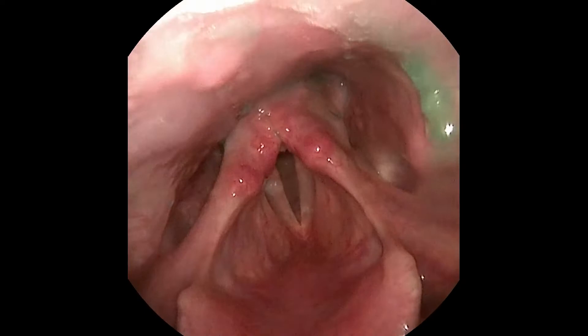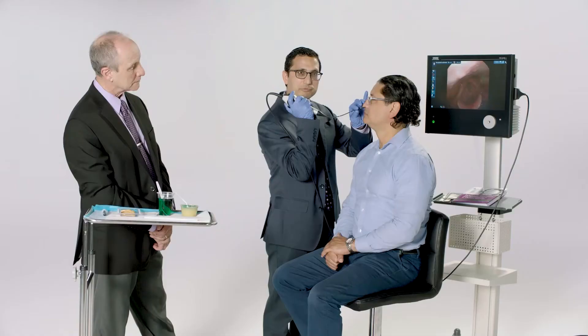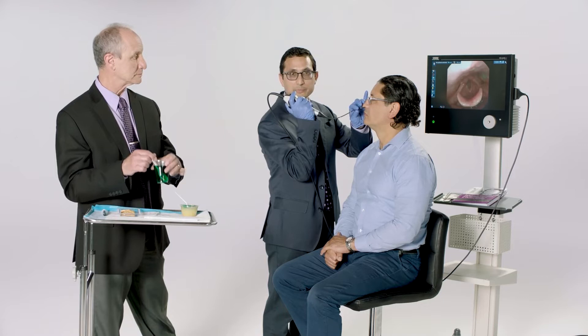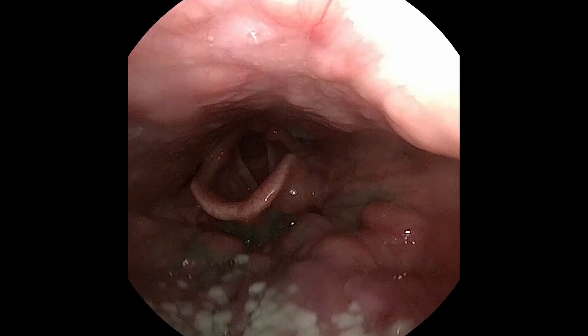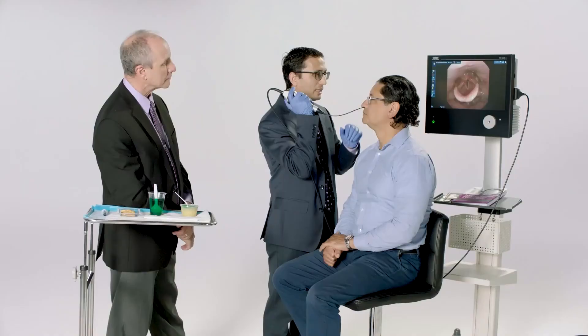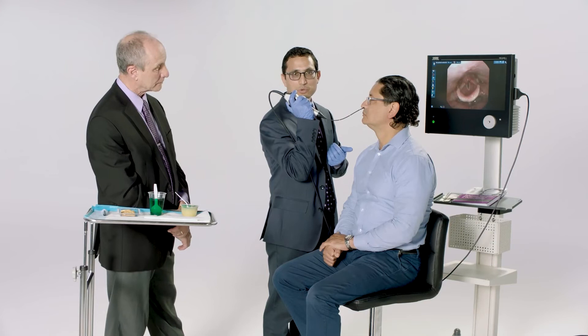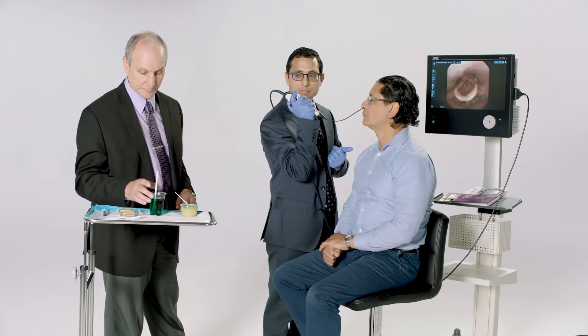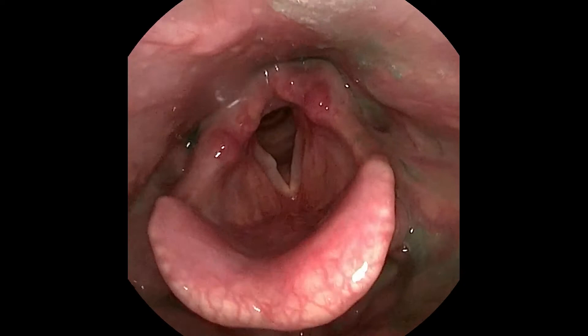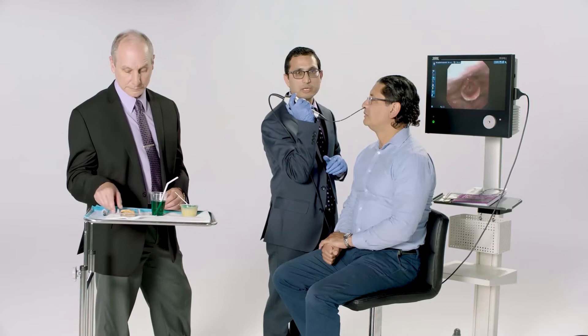Go ahead and say E. After the pureed food bolus, we test the patient with liquid. We can start with a small teaspoon if we suspect the patient may have difficulty swallowing. There is a small amount of residue in the pharynx, but otherwise no penetration or aspiration. We can then subsequently try with a sip from a cup or with a straw. Go ahead and say E. Great. The next bolus will be a cookie.